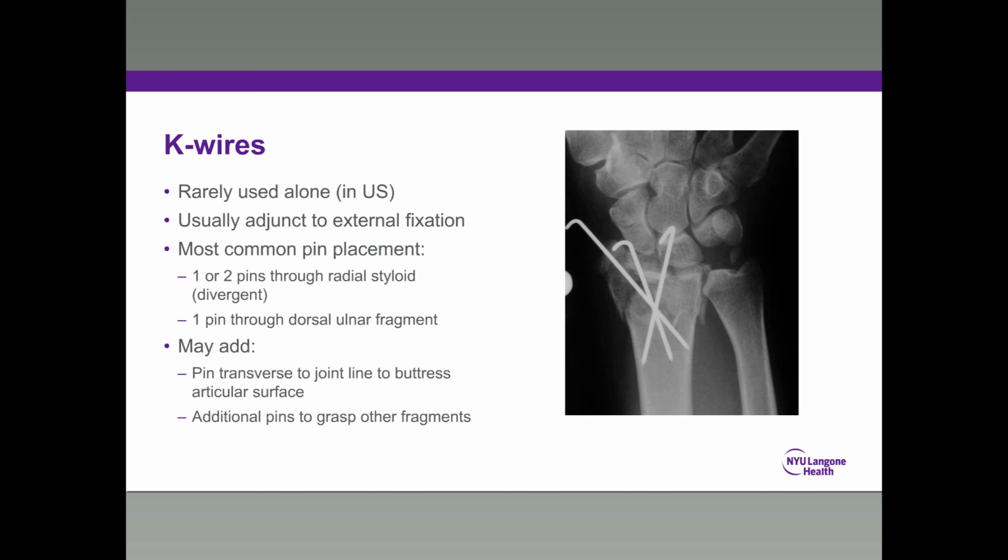There are some papers reporting on just the use of them. If they're used alone, they really need to be done not in osteoporotic patients because they're not going to hold, but in really good bone that you're choosing to fix this way, it is doable. Typically, though, people will use them as an adjunct to external fixation.